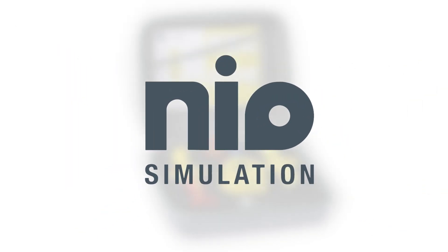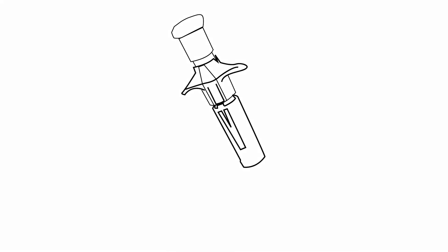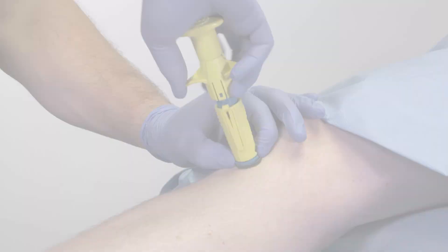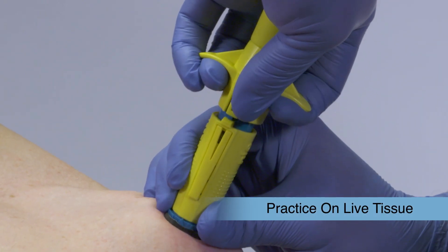The NIO simulation system is the most realistic intraosseous training system available, allowing users to safely deploy the device on other participants without deploying a real needle. This approach allows users to practice on live tissue, which reacts differently than cadavers or mannequins.